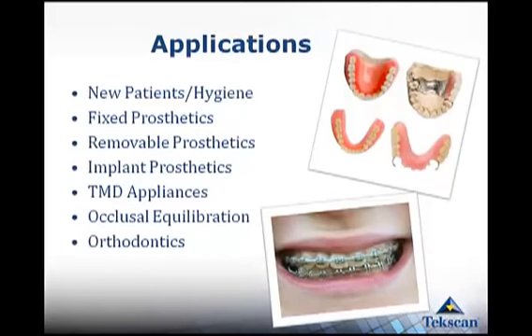Again, there's several applications here, and there's a lot of ways you can use T-scan. You've got to decide in your practice what ways make more sense for you. Obviously, our practice uses it in all sorts of ways. New patients and hygiene exams, being able to educate patients and help them see the problems, is a big way.